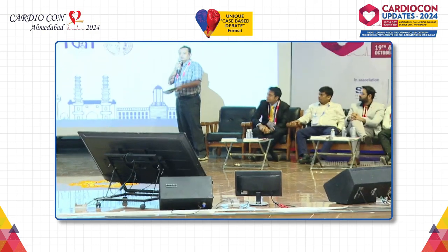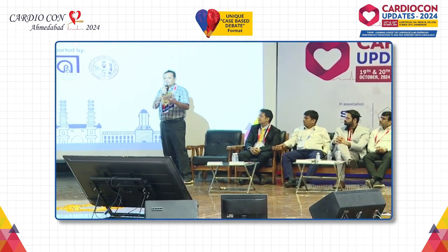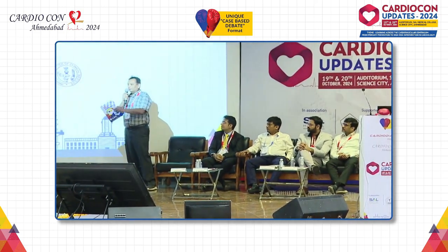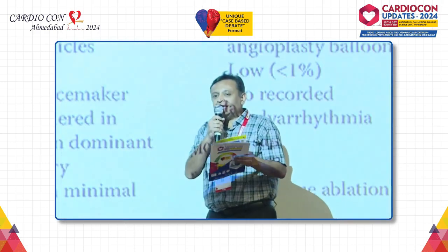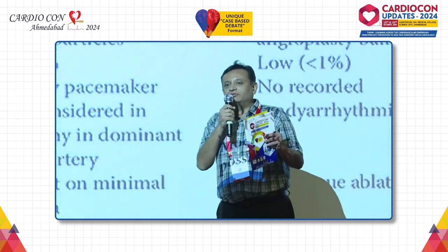And again, this case was specifically mentioned by Dr. Kamal sir. For this patient there are mainly two reasons. One is the TIMI-2 flow, specifically mentioned about preventing no flow with the calcium debulking tools. And second is the negative markers. The patient is not MI. So these are two things we have to decide about the further management.